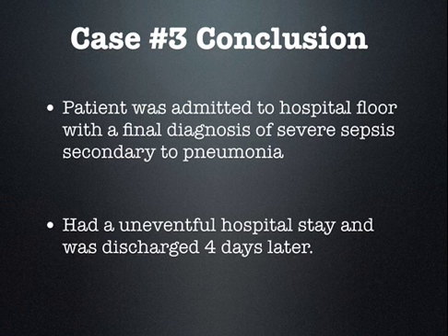So we saved this patient an ICU admission. And who knows, with the aggressive care that we felt comfortable doing with ultrasound, maybe we saved her life. I don't know. Can't prove that. So anyway, hopefully this illustrates to you the utility of ultrasound. Hopefully it inspires you to start using it yourself at your institution and maybe doing a little bit of listening to some podcasts or coming and scanning with us sometime, whatever you want to do. All right, any questions?